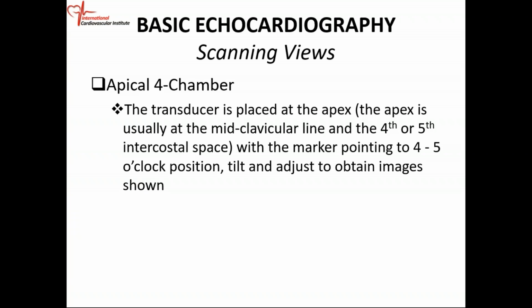So you're going to position your transducer now to get your apical views. And the first one we're going to get is the apical four-chamber view.